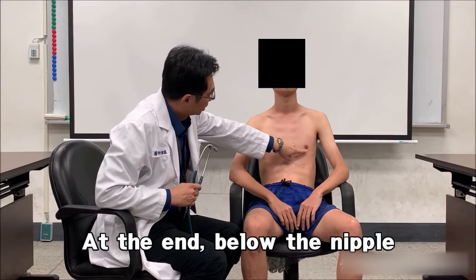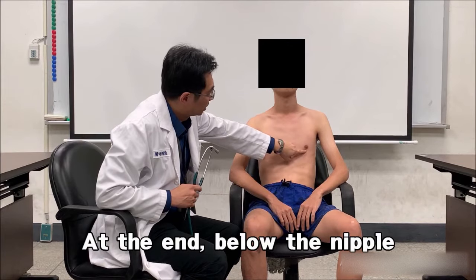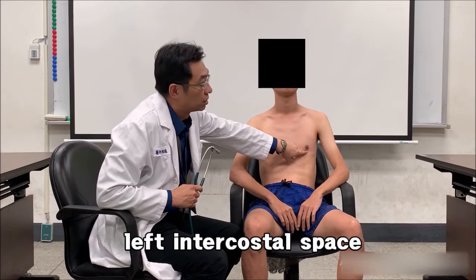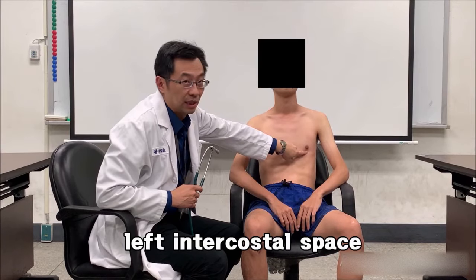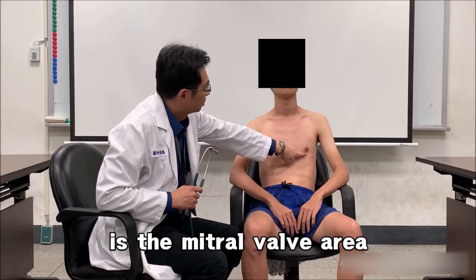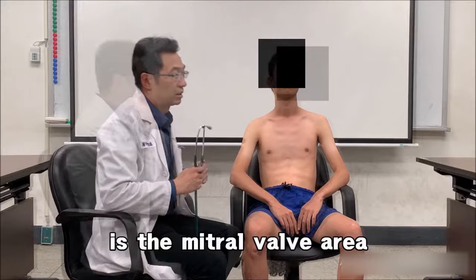At the end, below the nipple, about the fourth to fifth left intercostal space, is the mitral valve area.